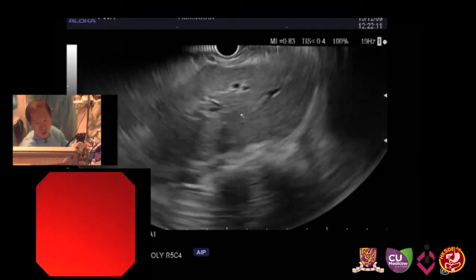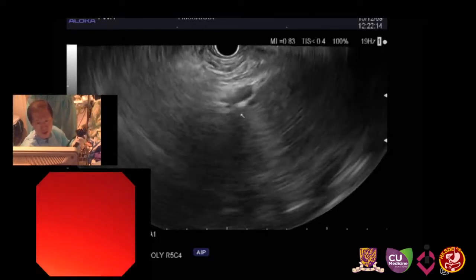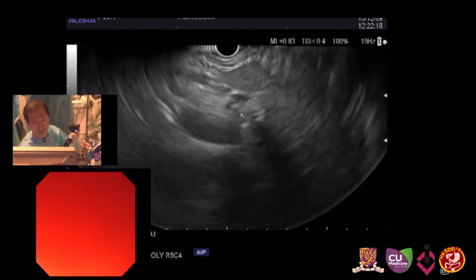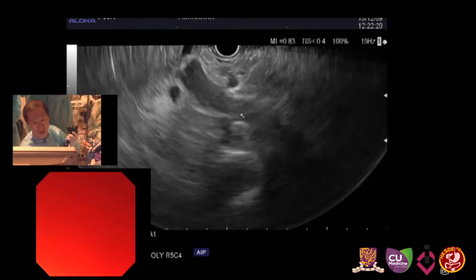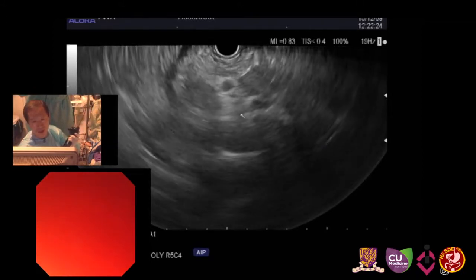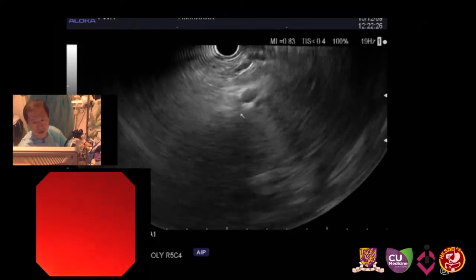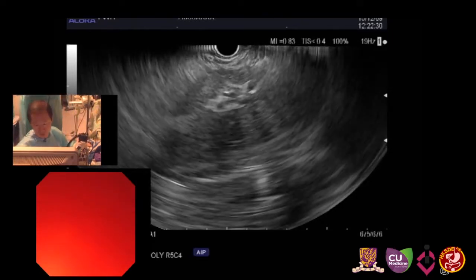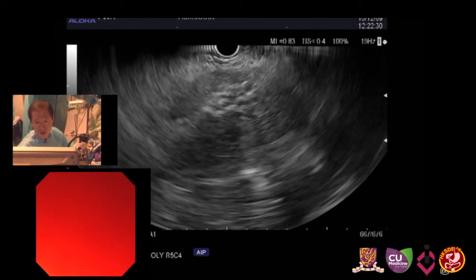I will trace for the landmark, portal vein is very important structure. This is main portal vein. From this is left portal vein. I'm reaching the umbilical portion of left portal vein here. This is umbilical area. Left lateral, left medial segment will be divided by this line.